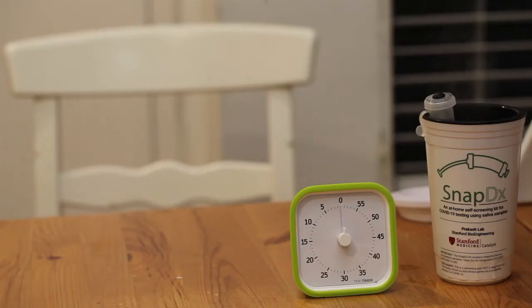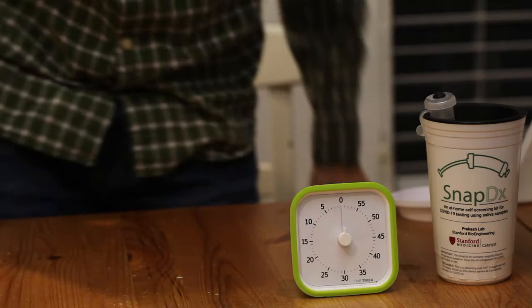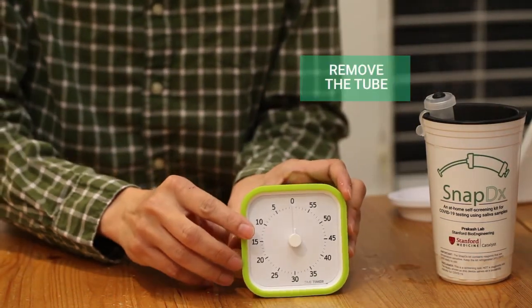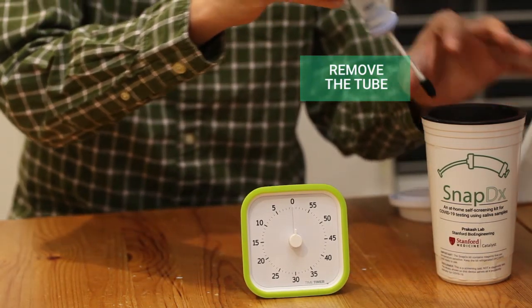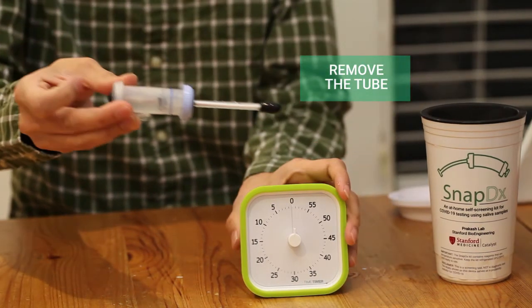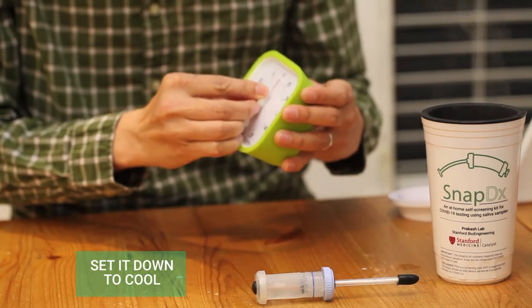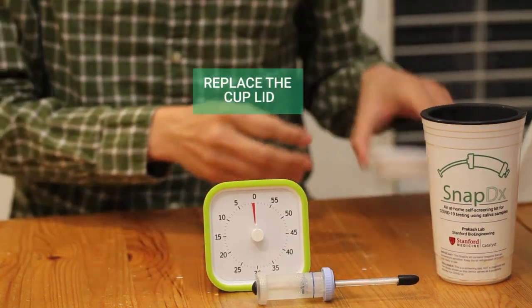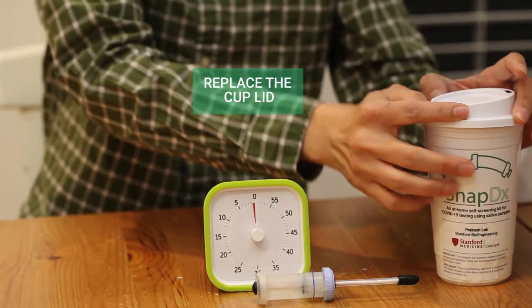Step 3. When the 3 minutes is up, carefully remove the SnapDx tube from the cup by holding the clip on the side to avoid touching the hot surfaces of the tube. The boiling process inactivates any active viral particles that may be present, so by this step the saliva sample is safe to handle without additional disinfection. Place the SnapDx tube on a horizontal surface and allow it to cool at room temperature for 1 minute. While waiting, put the lid on the cup of hot water and set it aside for a later step. Do not discard the water.